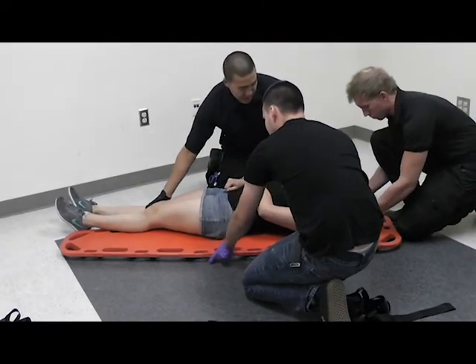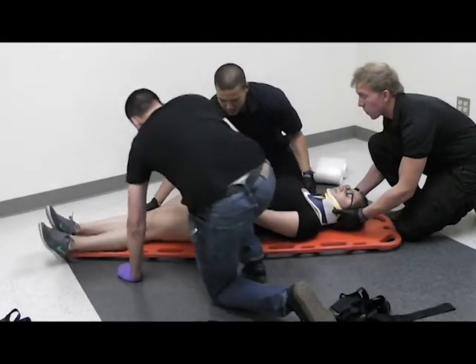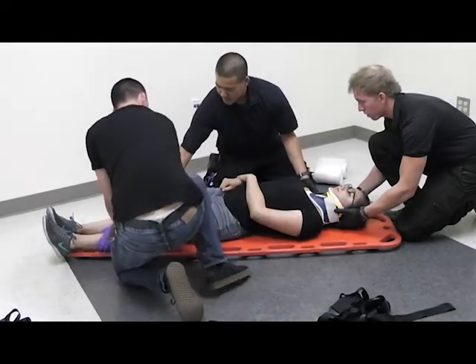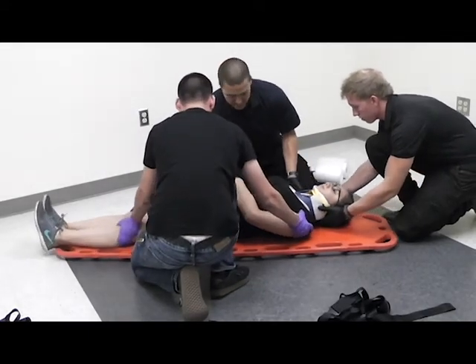Once the patient is in position, we can manually move her using a Z-drag. We will go down to the feet, grab on the side there — like this — Z-drag down, the other hand here, Z-drag down, and back up.